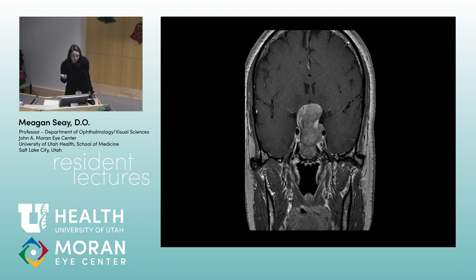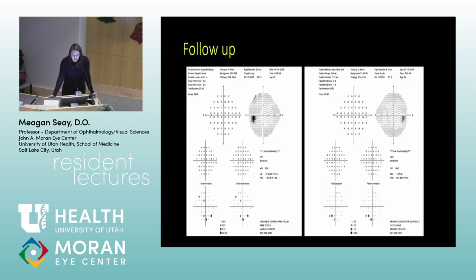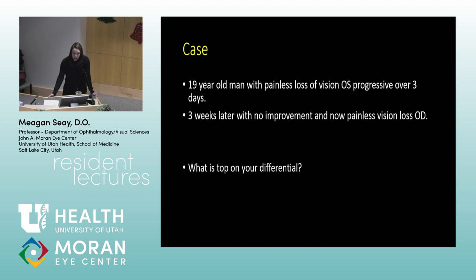So this is why our testing often brings out more information than just what they tell you and your exam. If you had done red desaturation, you probably would have picked up this visual field. He got that removed and had really good recovery with this. So, next case.